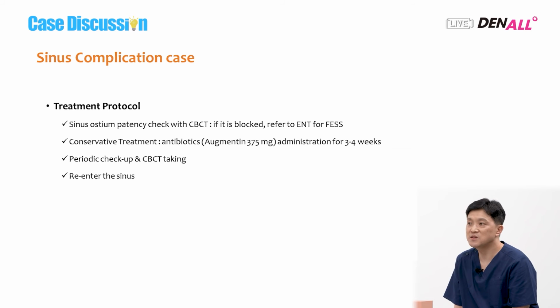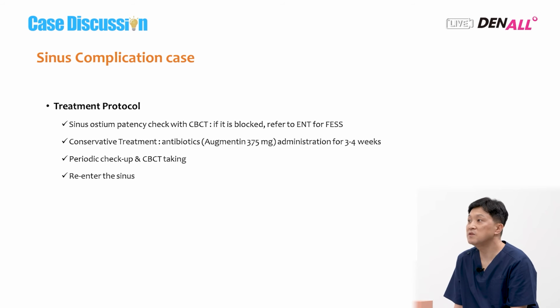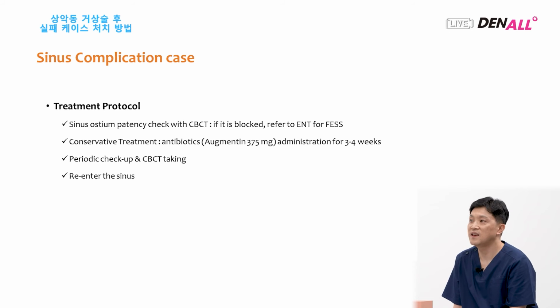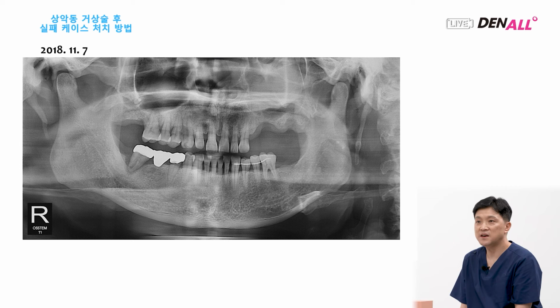If ostium patency is secured, I administer Augmentin for 3 to 4 weeks, and periodic checkup CBCT is taken. If the membrane is normal, if the thickening has subsided, I do the surgery. That's my protocol. This is my patient.